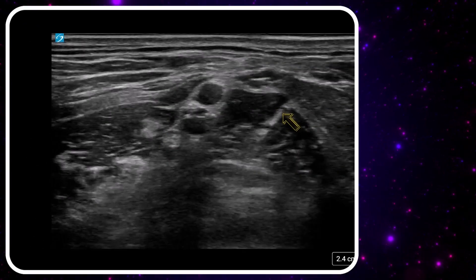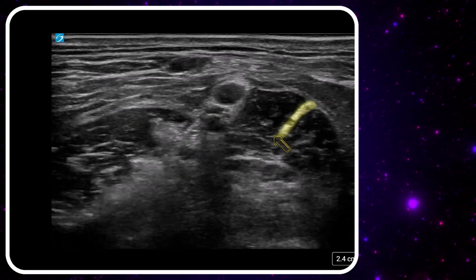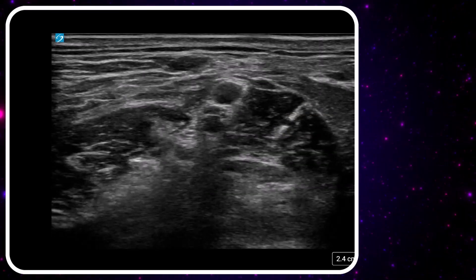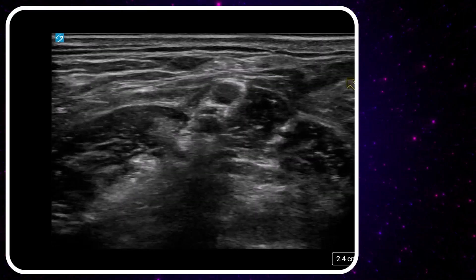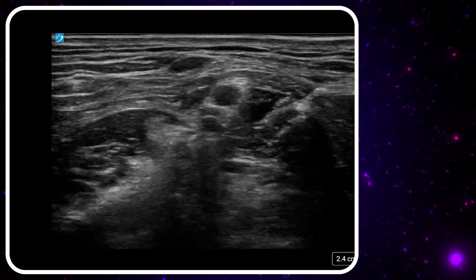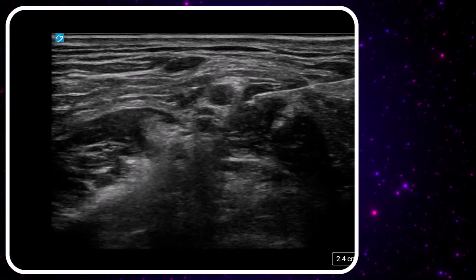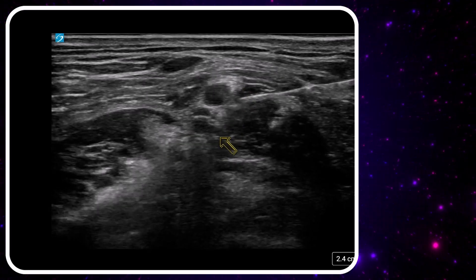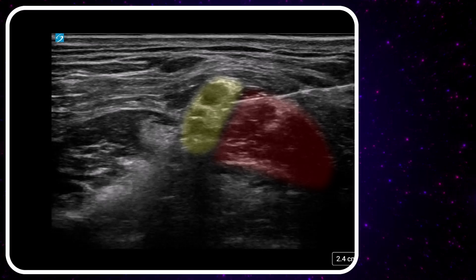We've also noted that we've got a nerve in the body of the middle scalene, and we're going to try and avoid that. We're going to pop in with the needle trajectory aiming this way, giving us a little space in case we overshoot. Our target is to get local anesthetic spreading between the brachial plexus and the middle scalene muscle.